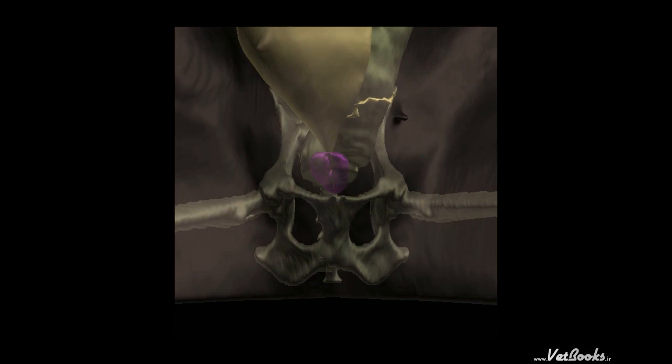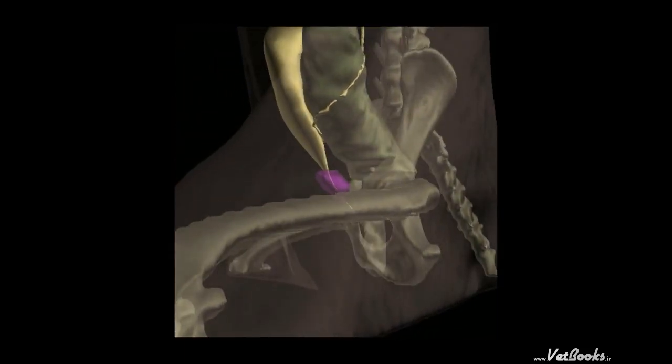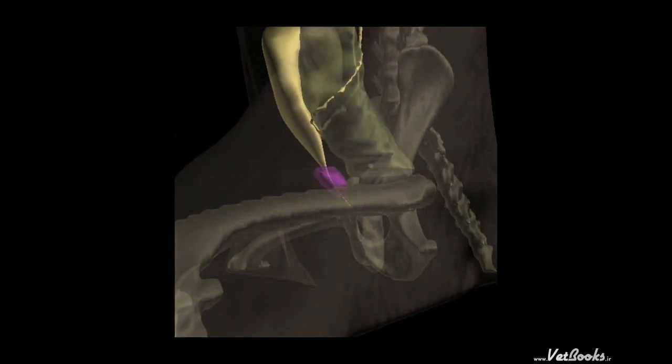The right and left prostate lobes surround the proximal portion of the urethra and are usually distinguished. Whereas the prostate gland will be small and weakly echogenic in a castrated dog, the prostate in an intact male will be larger, more spherical and hyperechoic. The normal prostatic lobe should be symmetrical and uniform in echo texture. However, in case of benign hyperplasia, small anechoic cysts may be recognized.